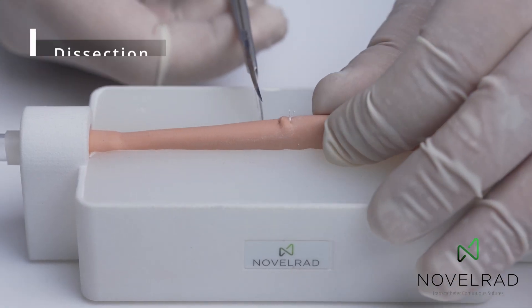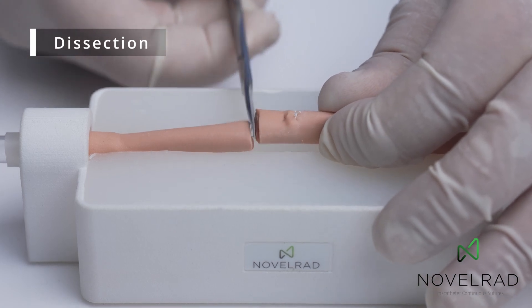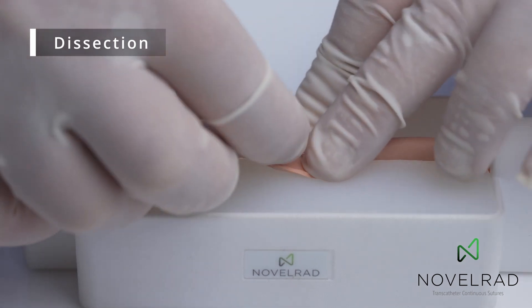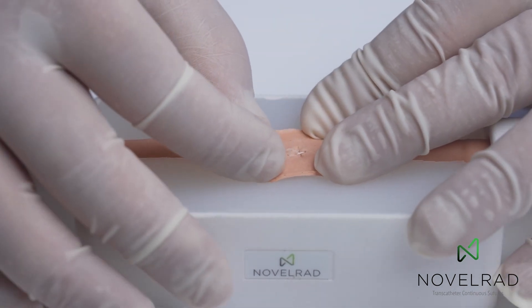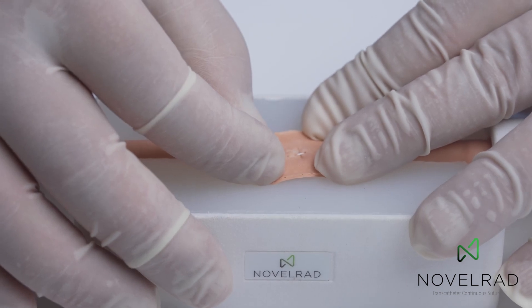If we take the artery and dissect it — just cutting on either side of the suture — you can see the suture. And as we open the artery, you can see the nice sutures and the full closure and approximation of tissue to tissue at the site of the arteriotomy.